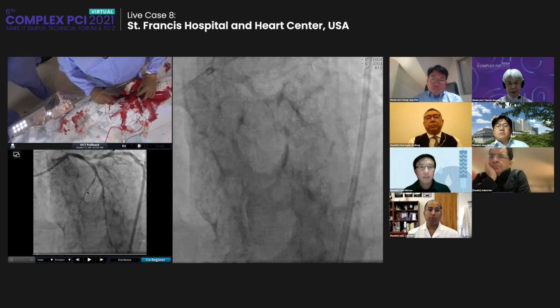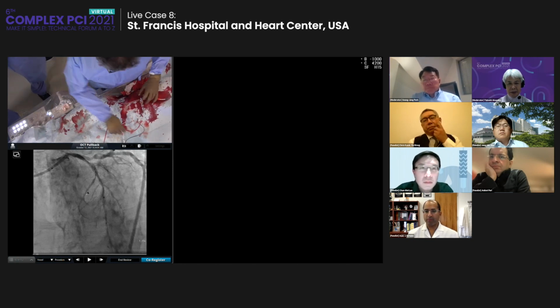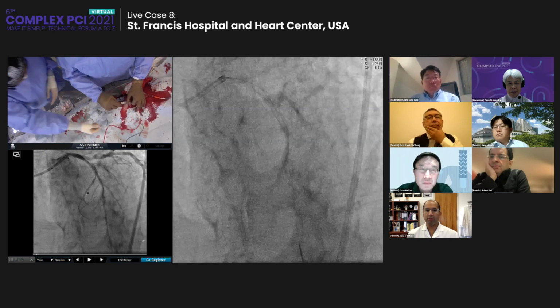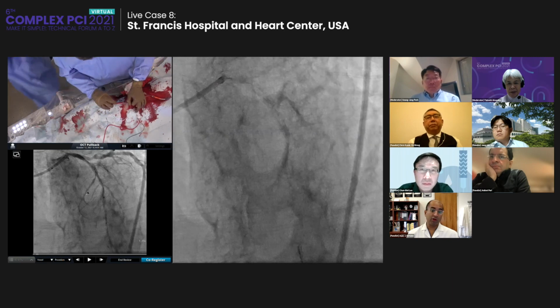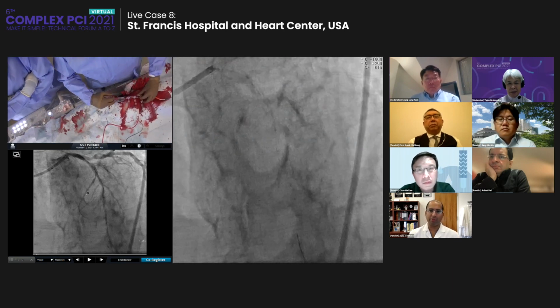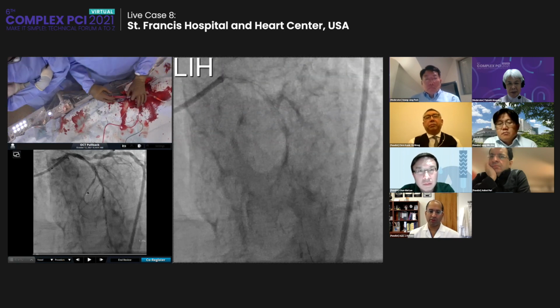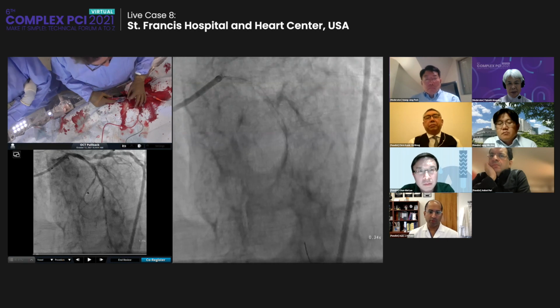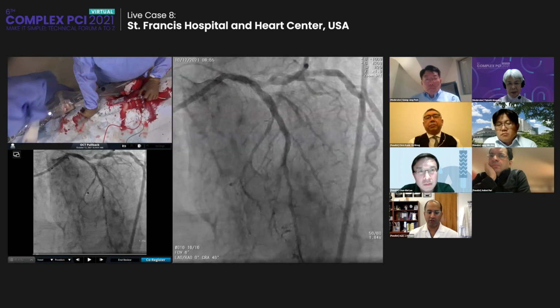And that's also important because early on, before it was approved here, a lot of folks were saying you may need hemodynamic support to be able to support the Shockwave. Now, our European colleagues and those in Asia told us no, you don't need to, because they don't use hemodynamic support. But I think, Rich, what you've experienced is similar to many others, including us: patients are quite stable during these inflations, and you can always come down.